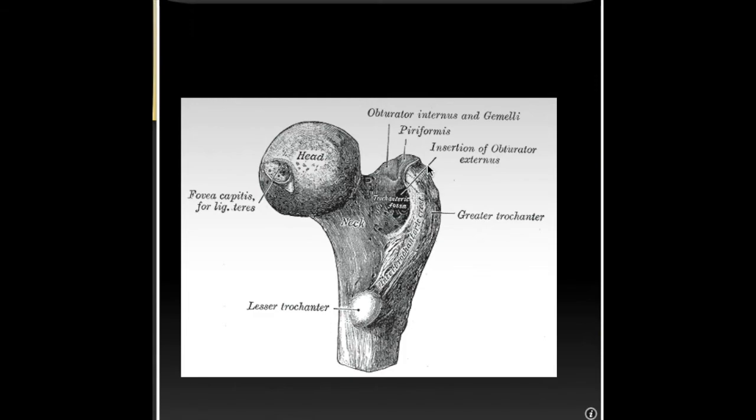Moving on, you're going to see that we sometimes describe moth-eaten or permeative lesions of the bone, and for the most part, although they're not necessarily the same, they're very similar, and the differential diagnosis is going to be visually the same. So I recommend you group these two together. And for the differential, it is going to be a round cell tumor, Ewing sarcoma, malignant fibrous histiocytoma is another common one, and fibrosarcoma. So those are going to be, for a single lesion, one of the first differential diagnoses that we're going to have in mind.